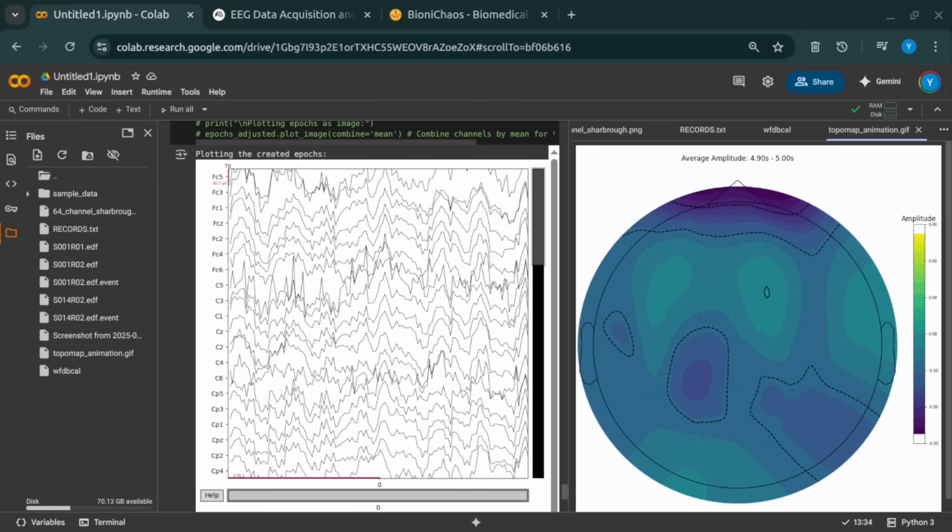What an incredible journey we've taken today, seriously. From wrestling with mismatched channel names and deciphering mysterious binary event files, all the way to creating a living, breathing animation of brain activity. It truly highlights the fascinating blend of technical skill, relentless problem solving, and sheer scientific curiosity required in this field. It really does. It's a powerful reminder that data is never just numbers. It's a story waiting to be told if you're willing to do the detective work.